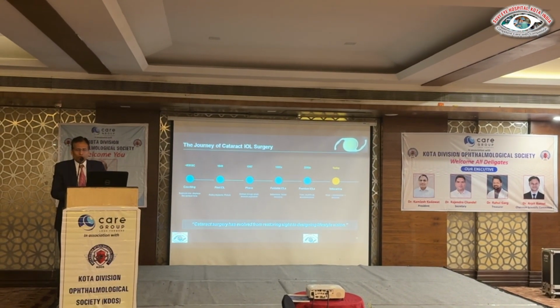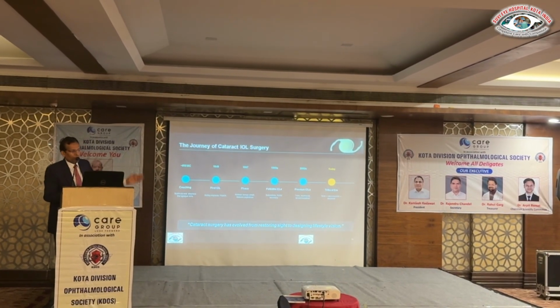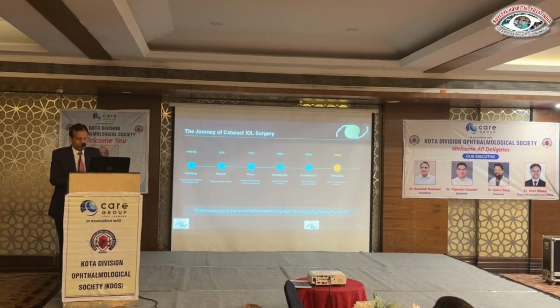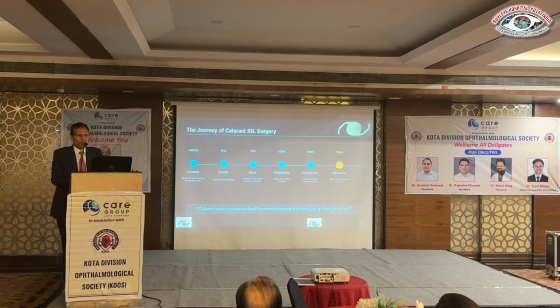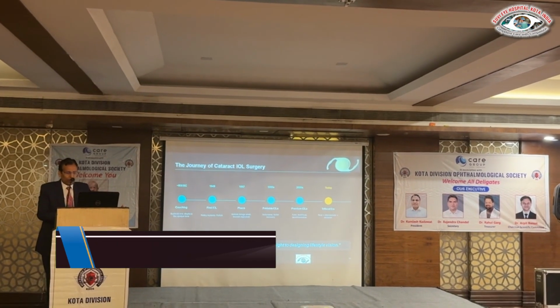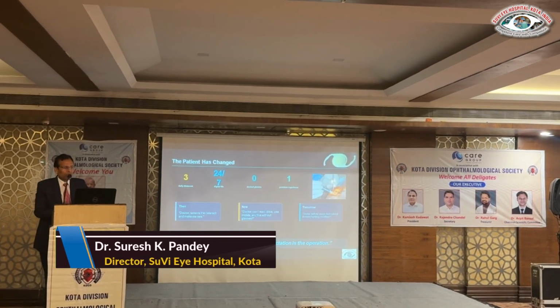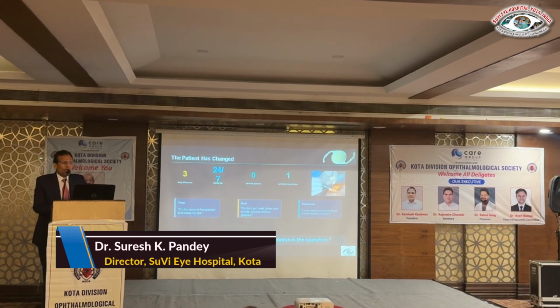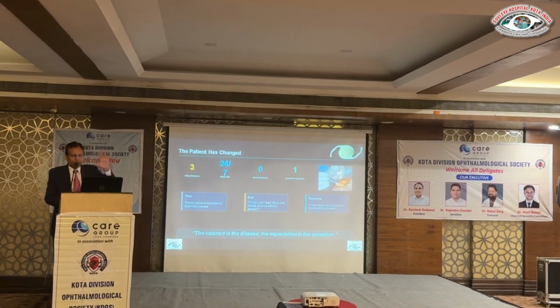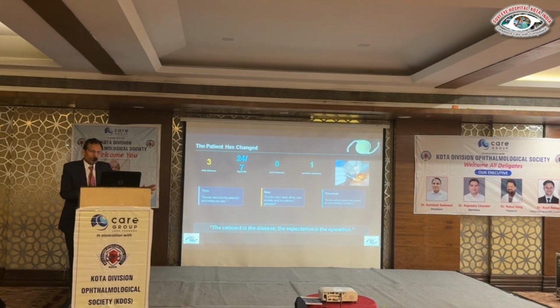So if we talk about the journey of the cataract surgery, we have read about the couching, the first IOL, then phaco foldable, and now we are living in the era of trifocal, EDOF, and the other premium lenses, toric trifocal, toric EDOF, etc. And during that time, patient used to come to the doctor, "doctor sahab, surgery karwa kar do, mera cataract nikal do." Now the time has changed.